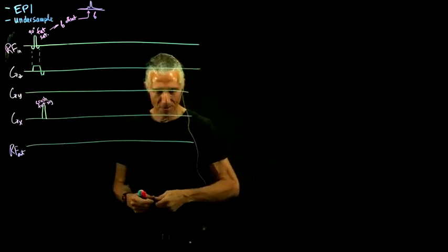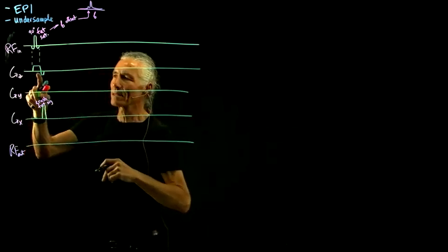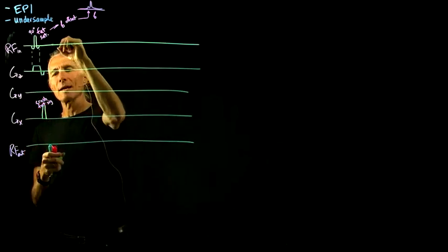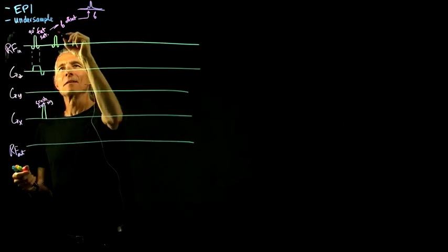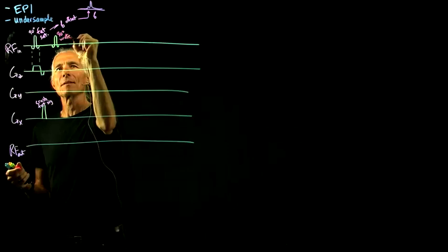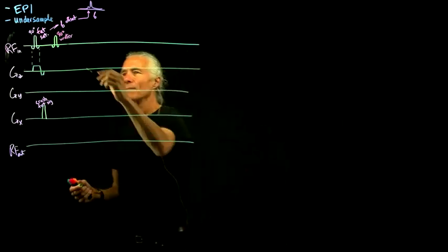Then we're ready to actually do, and that doesn't take very long, because we make a signal, but then we can quickly hammer it to make it go away. And then we do our water 90. So this is another 90. This is water. So that one is set up for the frequency of water.